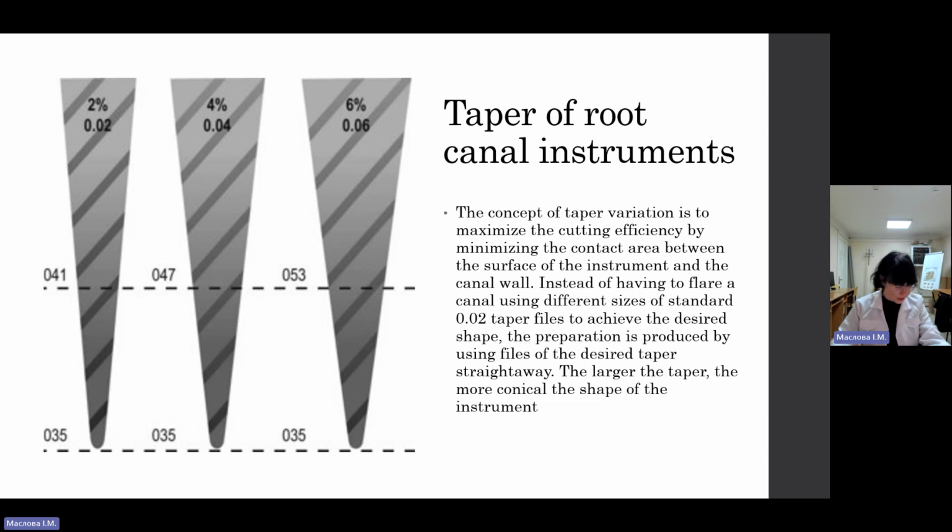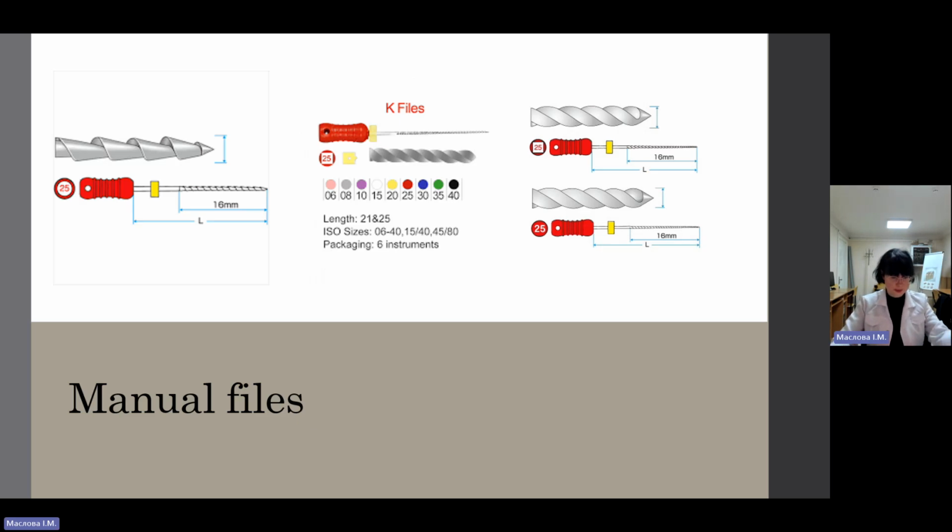Endodontic hand instruments include reamers. And I'll show you this instrument. Reamers are manufactured by twisting a tapered stainless steel blank to form an instrument with a shaped cutting edge along the spiral. They are used with a half-turn twist and pull action, which shapes the canal wall, removing dentine chips from the root canal. Nominally, they have a triangular cross-section, but in smaller sizes they may be manufactured from a square blank.